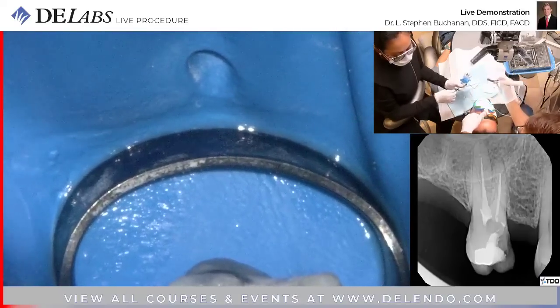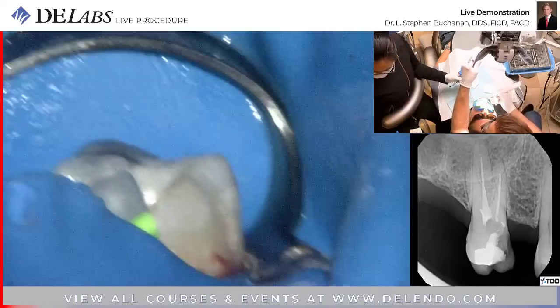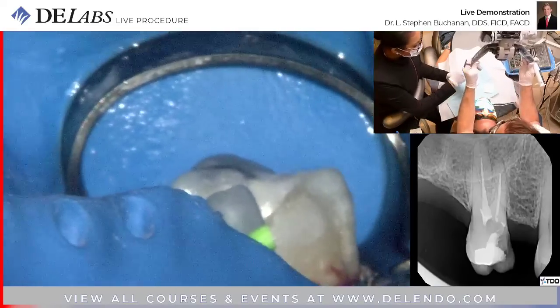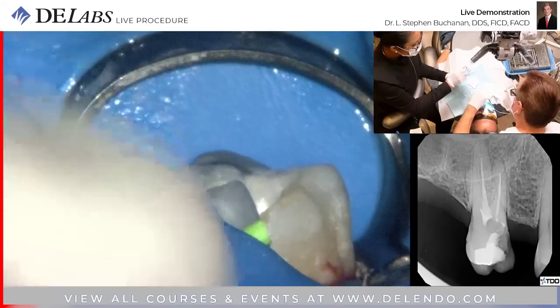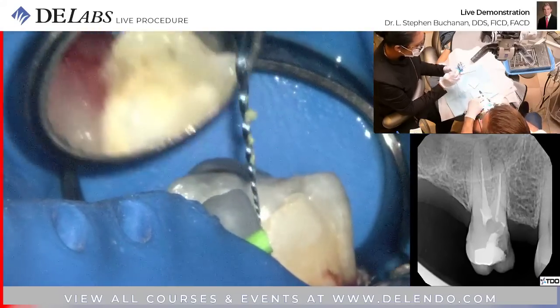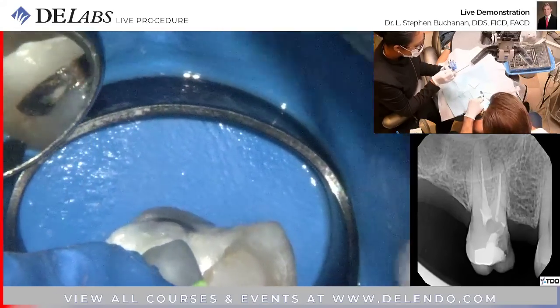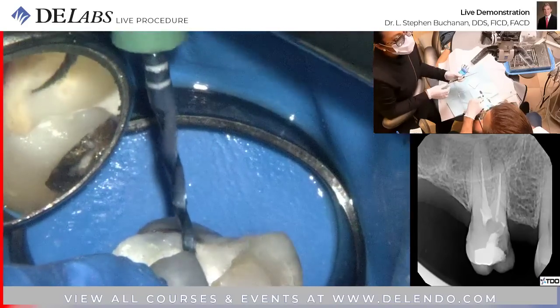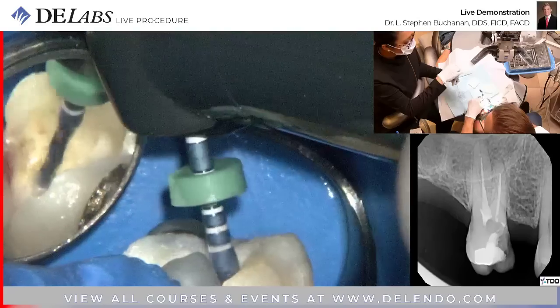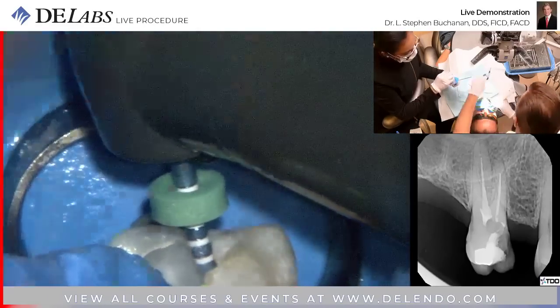Okay, so those are two-thirds done. Isn't that awesome how it just starts itself? These guys are nuts. They're such good designers.